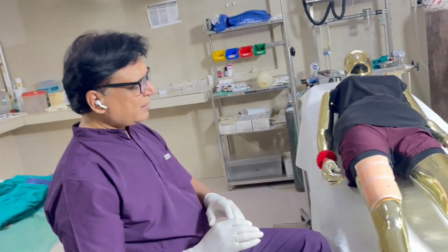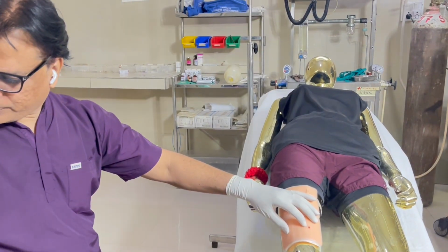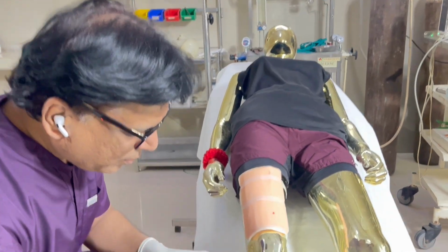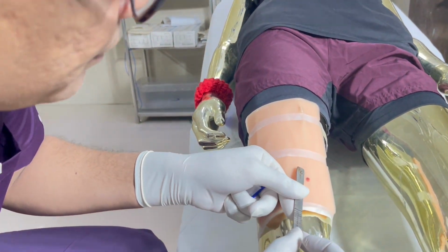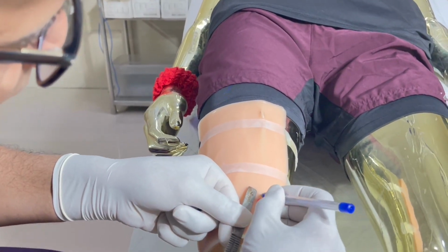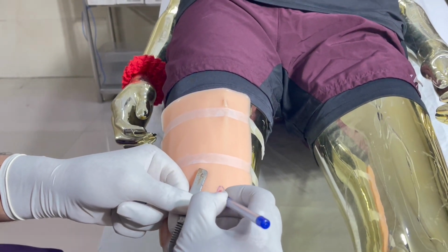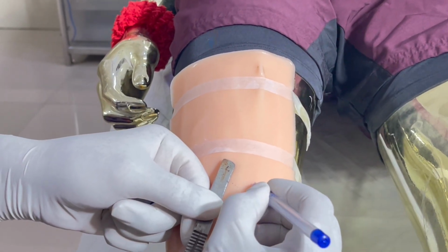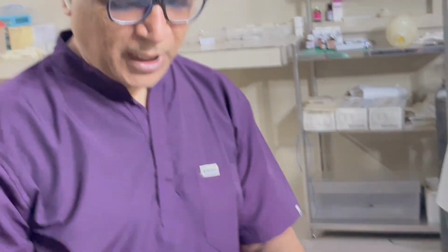Before that, I will just mark the mole with a scale, just to understand how much I have to remove. So it should be 1 centimeter above and 1 centimeter below, and around 3 to 4 millimeters on the side. Once I mark this small ellipse, I will be removing this part.